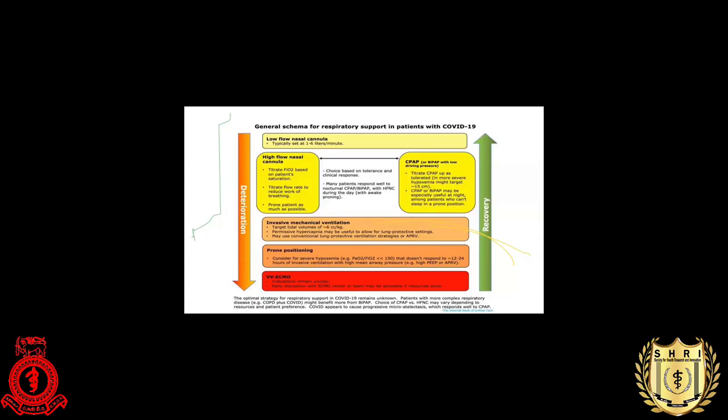I think Bhaginder, they're asking about the effectiveness of an oxygen concentrator machine for providing oxygen in high flow therapy. Oxygen concentrators usually don't give high flow. They usually give 5 liters per minute, but there are some modern versions which give about 10 liters per minute. So you can't use it for high flow oxygen therapy unless you convert it with some high flow device. Just an oxygen concentrator, no high flow.